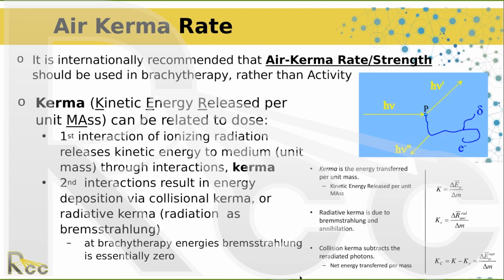So what is the air Kerma rate? This is the recommendation. Rather than converting it to activity, it's advised to just stick with that measurement value. So then you're comparing what they measured to what you measured, not using that intermediate activity.